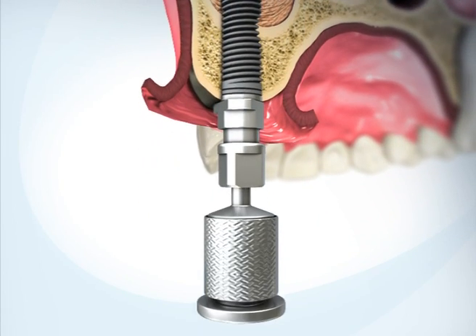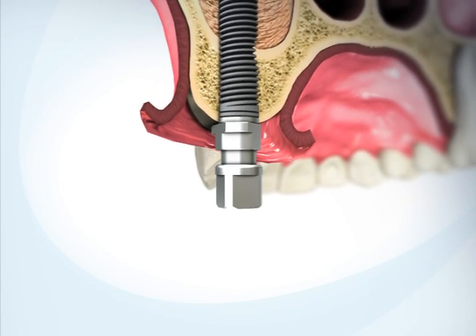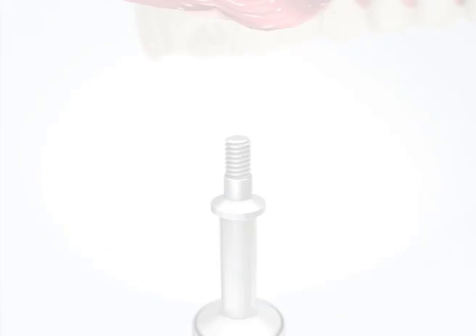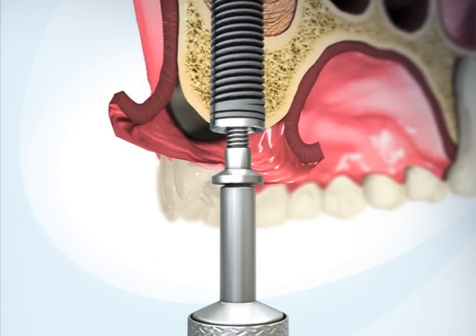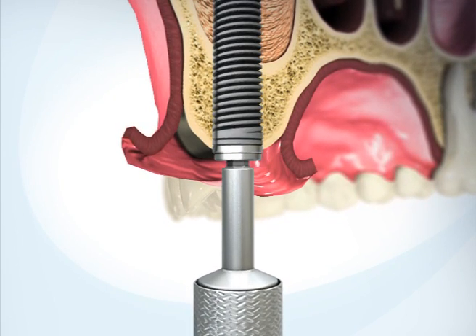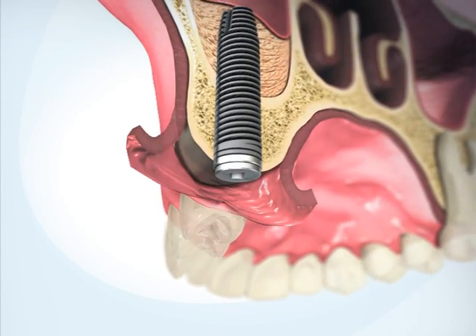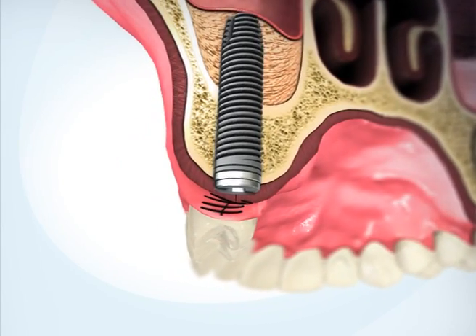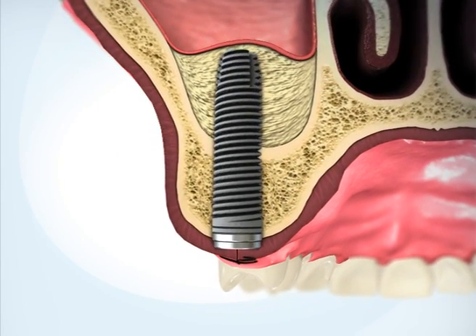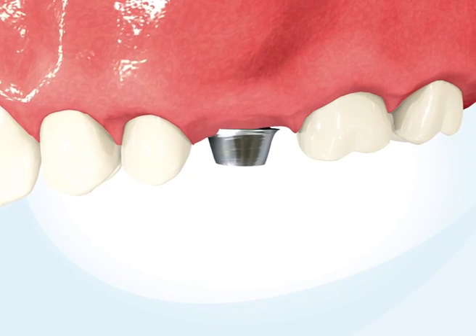Remove the applicator. Insert the cover screw and suture the gingiva. Over several months the bone graft will mature and the implant will integrate with the newly formed bone. The crown is then installed upon the implant.